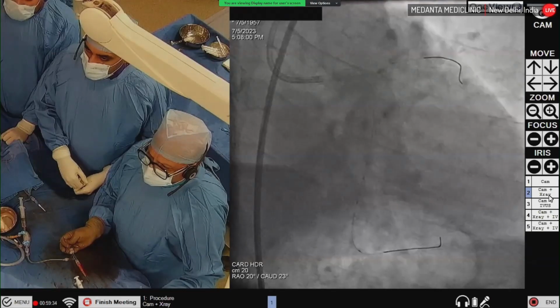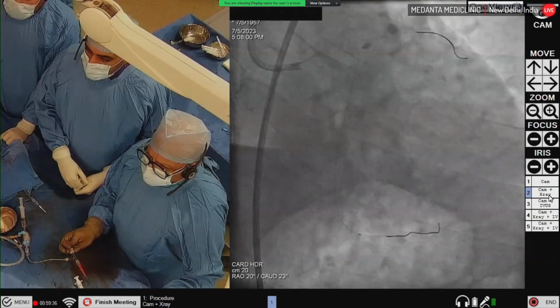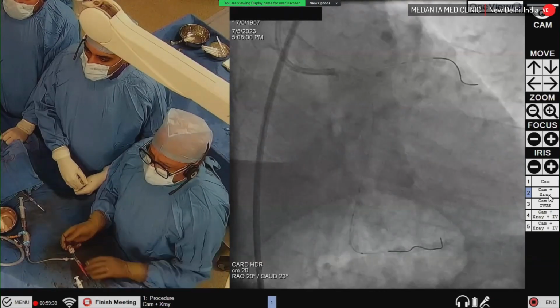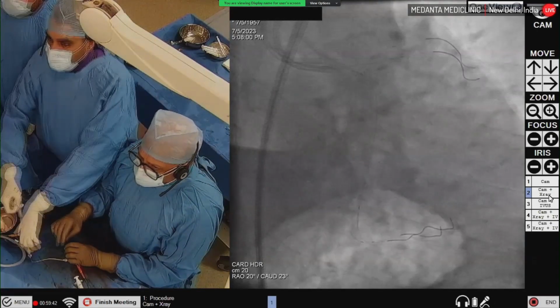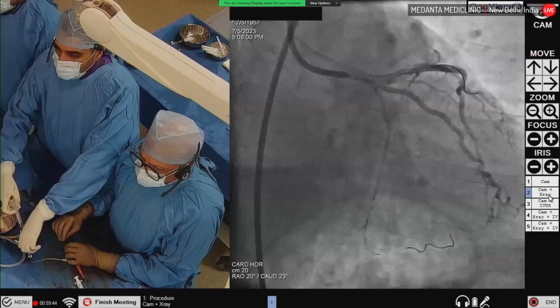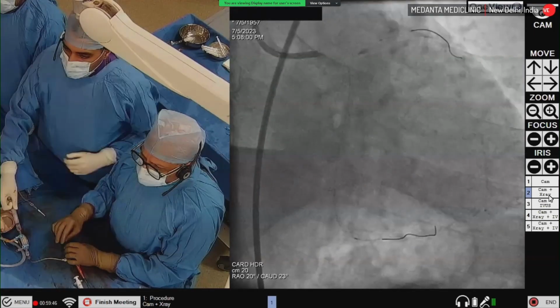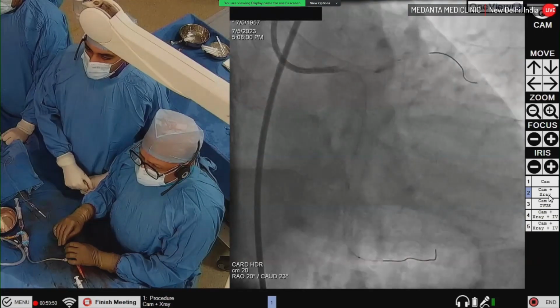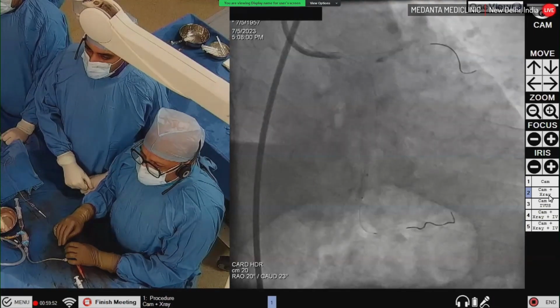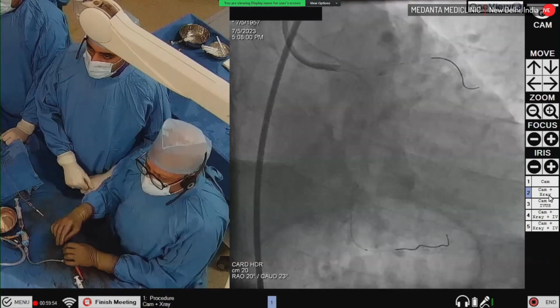Okay. So this is a very tight lesion down, but we will persist a little bit and it will go. Check now. Because as I said, these balloons are quite okay for crossing. Go up. So we have crossed it. Go up 2, 4, 6, 8, 9, 10. Okay, deflate.